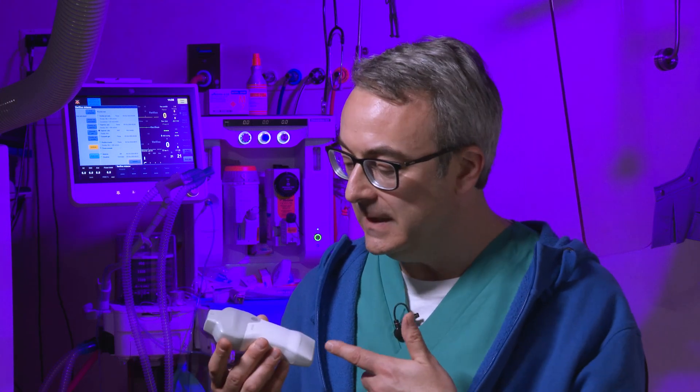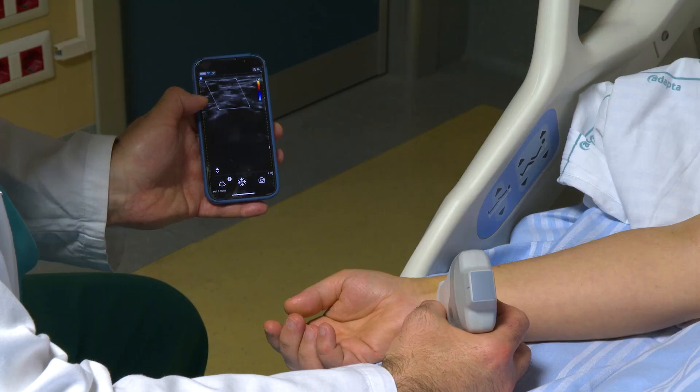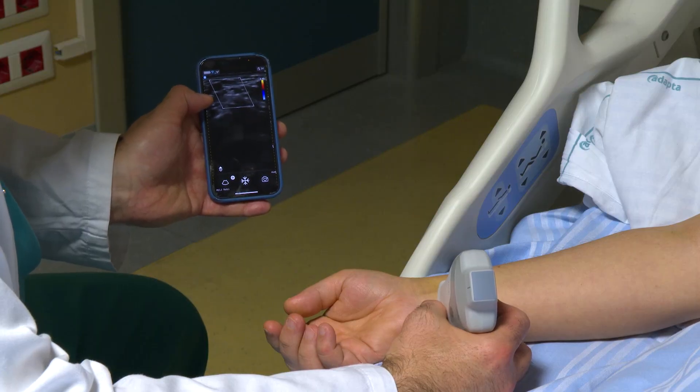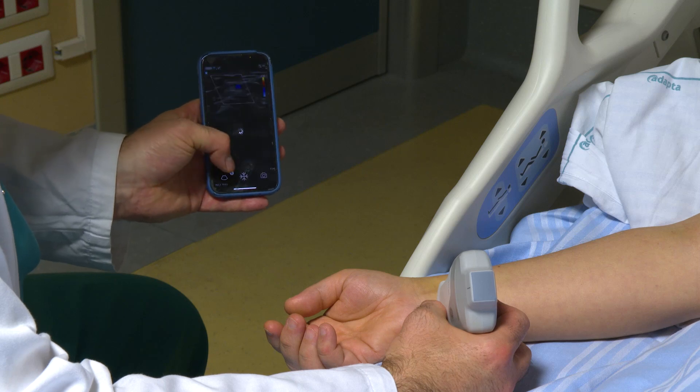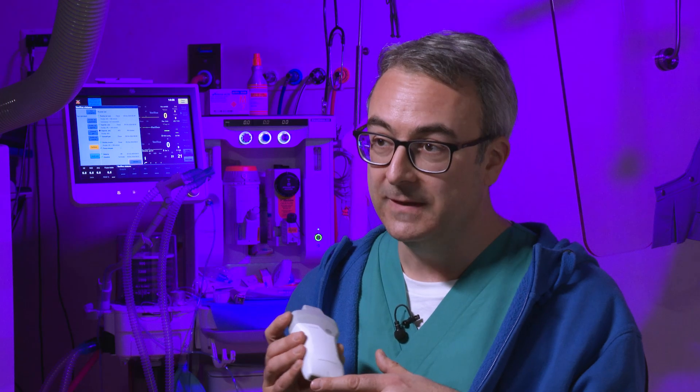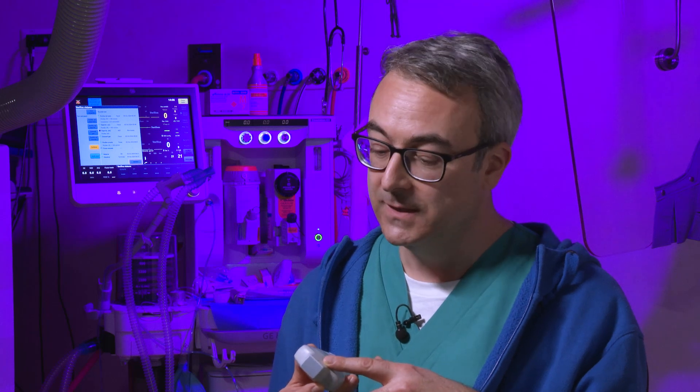You can use it almost immediately. You can watch the images on your phone or your tablet. And it's also very versatile because you have two transducers — you have the vascular transducers, the linear transducers, and the echocardiographic transducers.